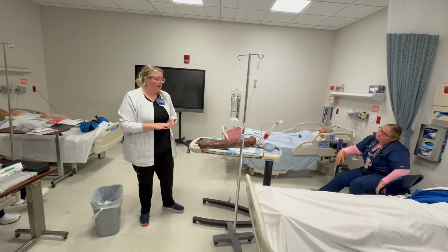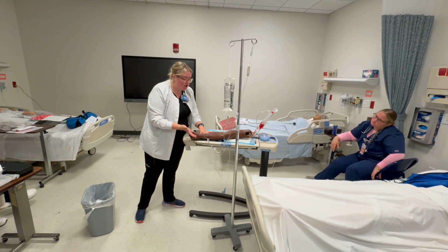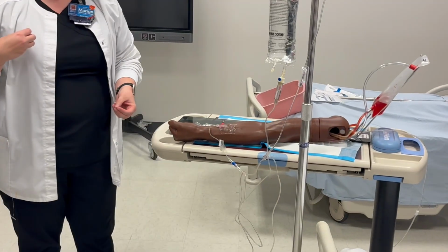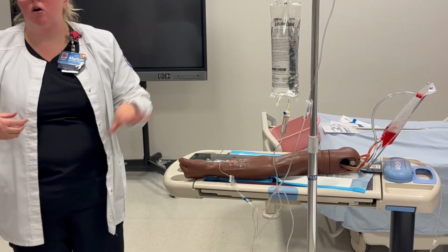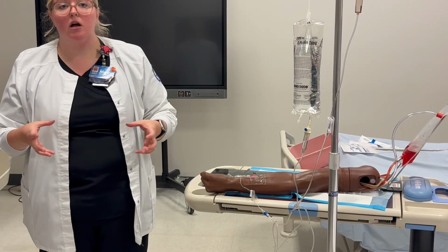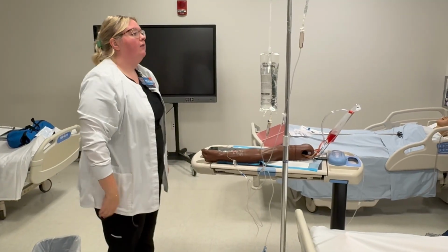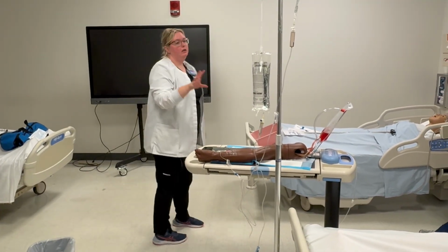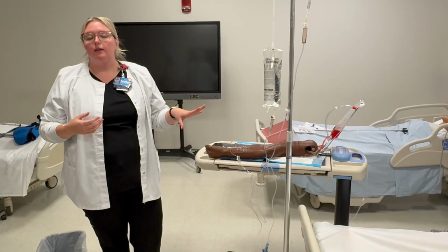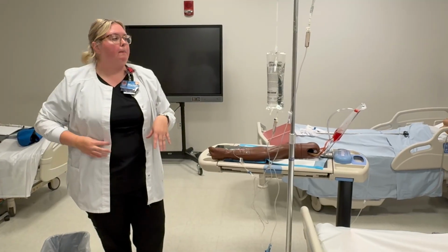Another thing I'd want you to do is look at your IV site. I don't see any infiltration. I could also take this off and pull back and check for blood return to make sure all my other stuff is correct. You don't have to actually pull that apart in checkoff. I just want to know that you aren't going to set your stuff up and say, bye patient. You have to look and make sure your medication is infusing. If you walk away and don't check, that's a missed dose, that's a medication error, okay? And you have to report that, okay?